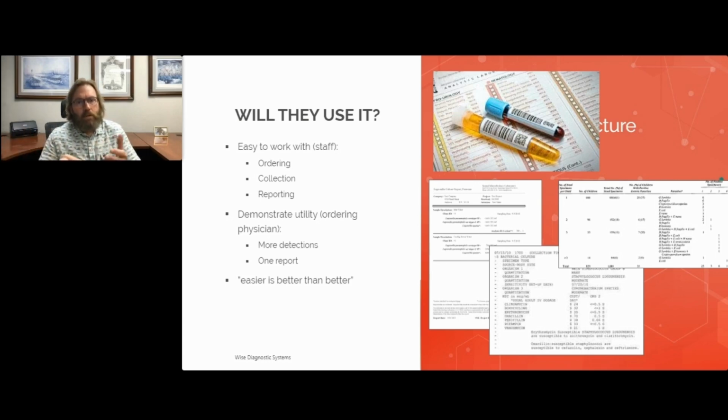And by that I mean that you have to compromise on maybe the number of tests that you can offer because there's too many jars or too many swabs required. If you have to compromise on something like that, to make it so simple that maybe it's not the all-encompassing everything test that your clinician wants, it's got the 90% solution and is so simple that they're getting results back and they're able to treat those patients as quickly as possible.